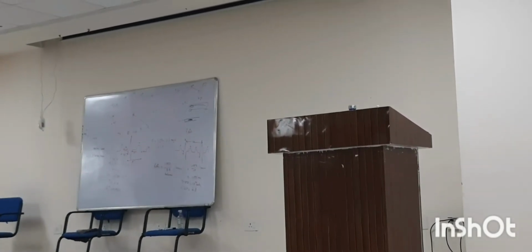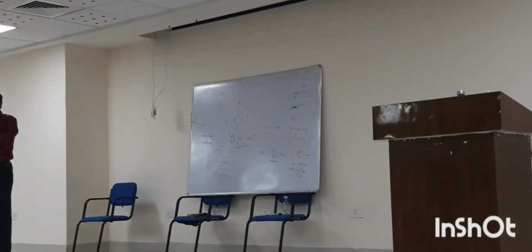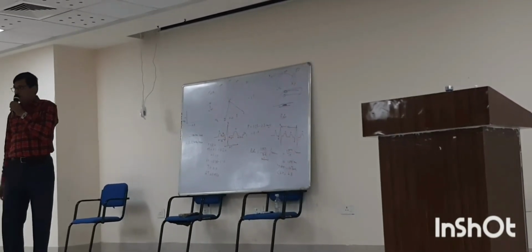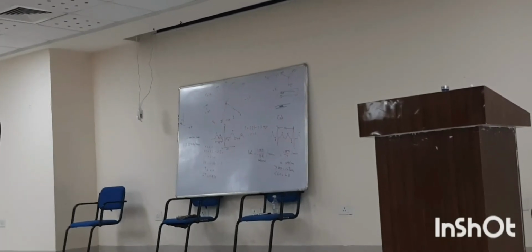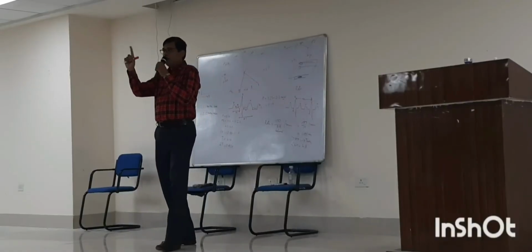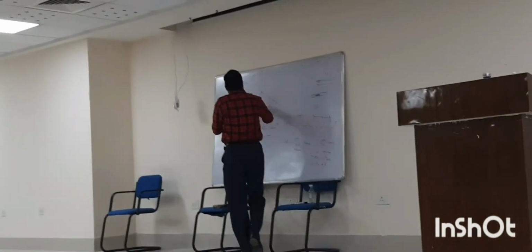And what is the mean electrical axis? It is directed downwards towards the left and it makes an angle on an average of 59 degrees. Suppose someone takes a tracing. Consider lead 1 and lead AVF, because this is a 90 degree angle.